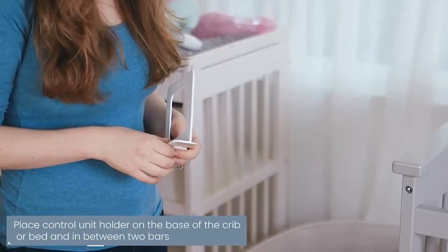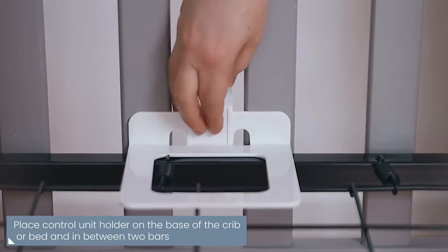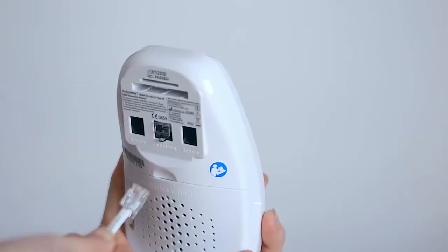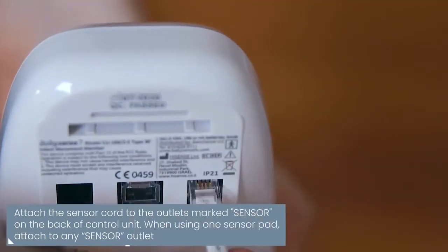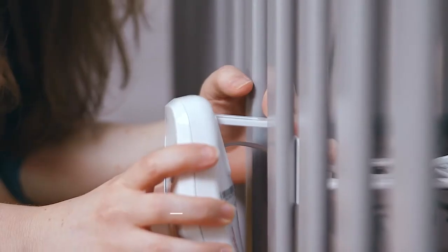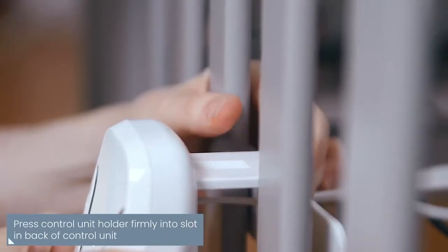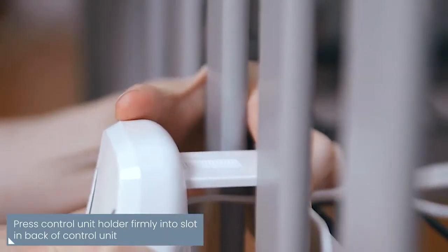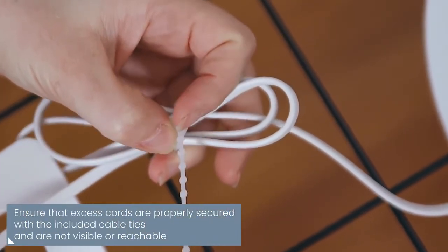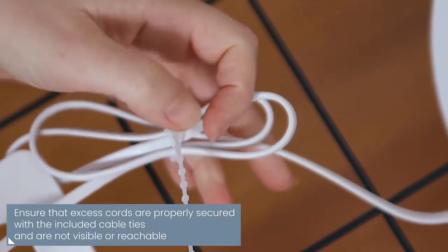Place the control unit holder on the base of the crib and in between two bars. Pass the cord of the sensor pad through the special openings in the holder. Attach the sensor cord to the outlet marked SENSOR on the back of the control unit. Press the control unit holder or hanging hook firmly into a slot in the back of the control unit. Ensure that excess cords are properly secured with the included cable ties so your baby can't reach them.